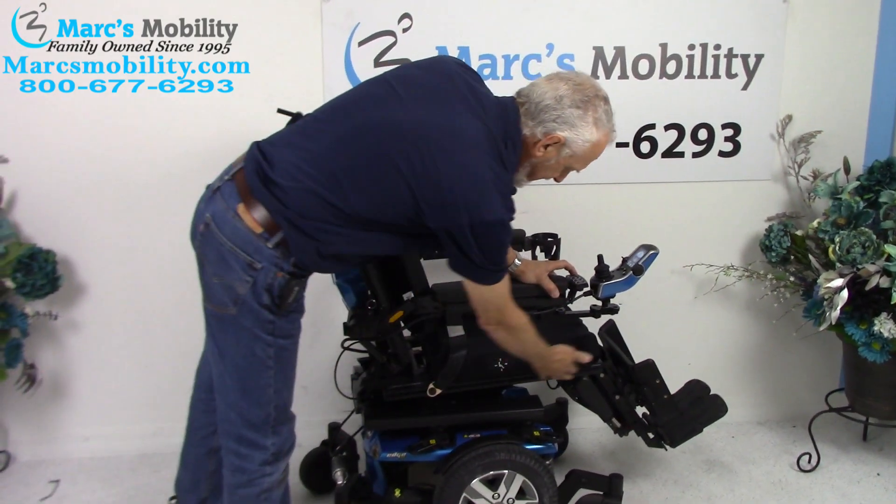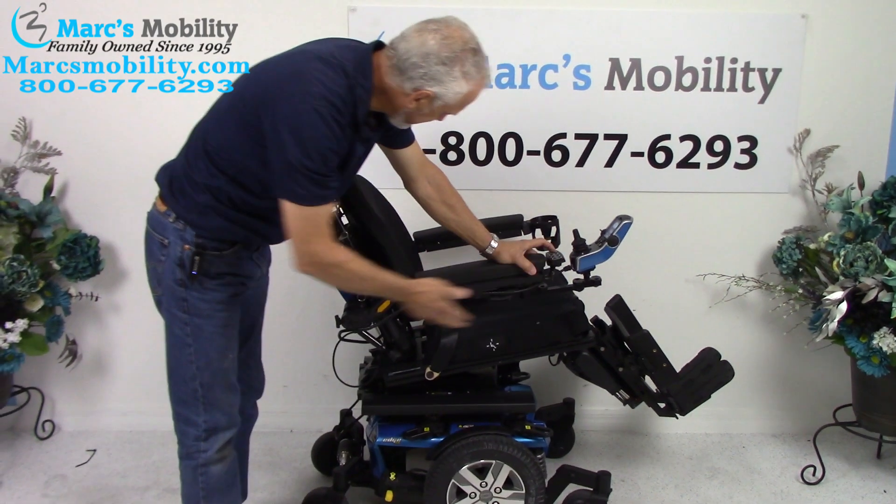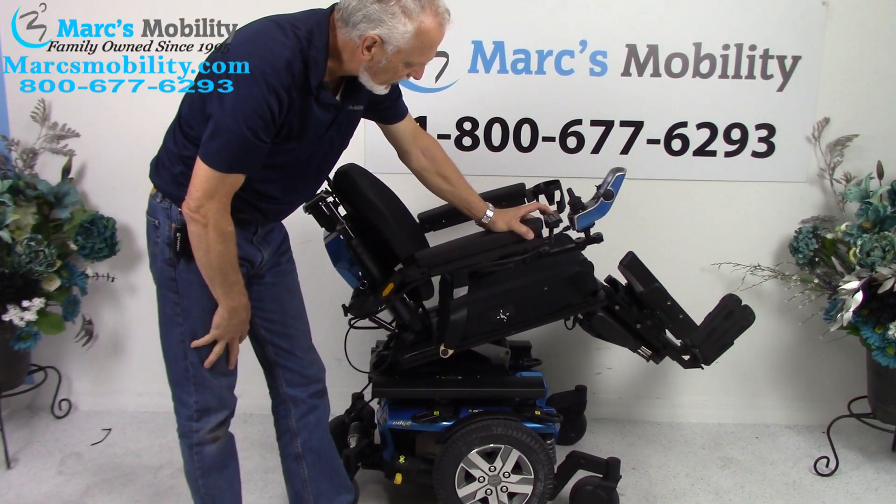The electric tilt is when the base right here goes back. When the base goes back, it's going to take the legs and it's going to take the back because they're all connected together. This is called the electric tilt.